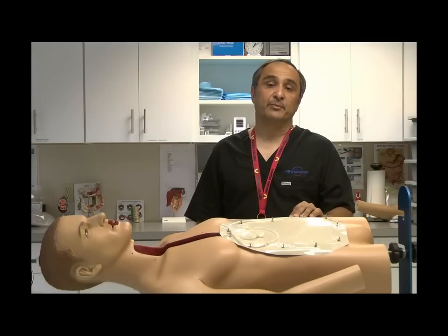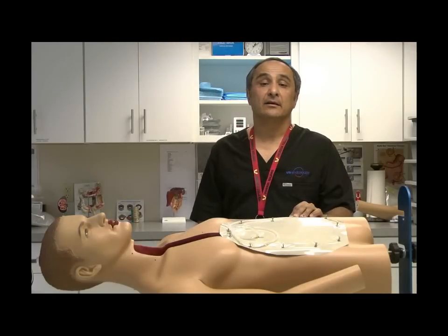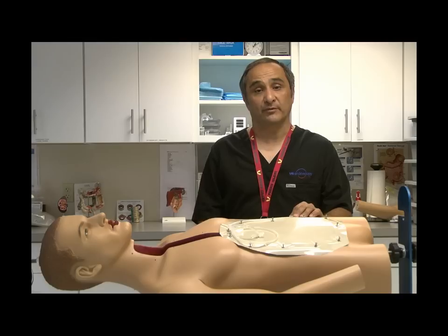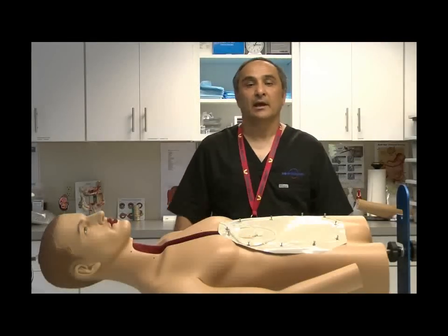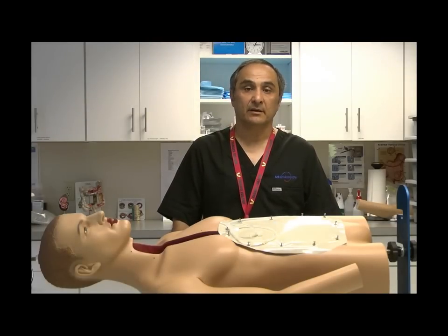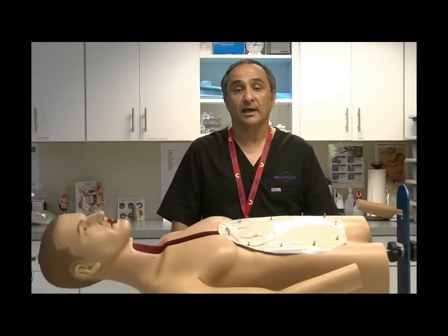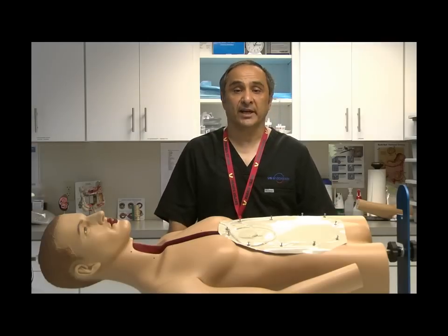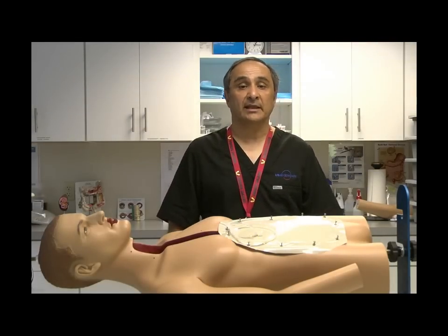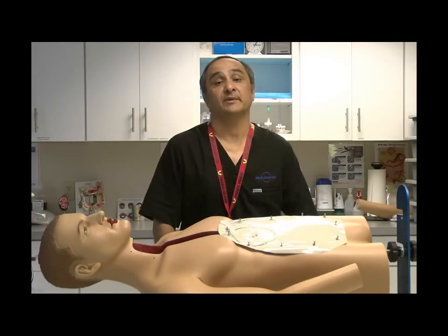The non-balloon replacement peg tube is intended to be used in an existing percutaneous endoscopic peg site once the original peg tube has been removed. During this video, I will be discussing the removal of the existing initial placement peg device, the prep and insertion of the new non-balloon replacement peg device, and then lastly, the removal technique of the non-balloon replacement device. And we'll also discuss and demonstrate the various items that come in the 0821 non-balloon peg replacement kit.